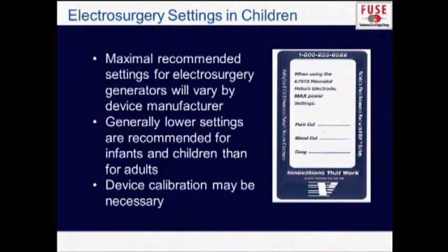What's important when you're operating on neonates is that most of the time devices should be calibrated specifically to measure your maximal power setting that should be used to achieve a specific current. And I will say that this shows a specific Valley Lab label, and I'm not endorsing any particular product, but I've never seen these used in our operating room, but it is recommended that each device is individually calibrated by a biomedical engineer, and that's what you need to do to be safe.